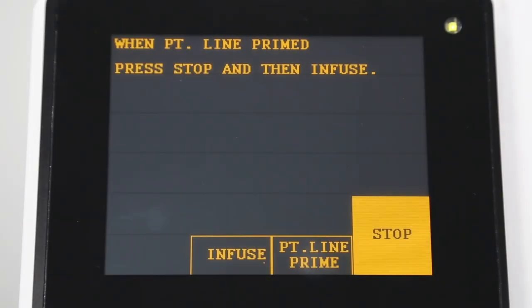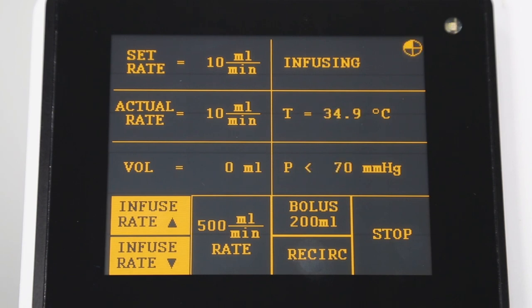Once the system is connected to the patient, press infuse to begin operation. Infusion will automatically start at 10 mL per minute. Infusion rate, set rate, total volume infused, temperature of the fluid, and line pressure are continuously displayed.